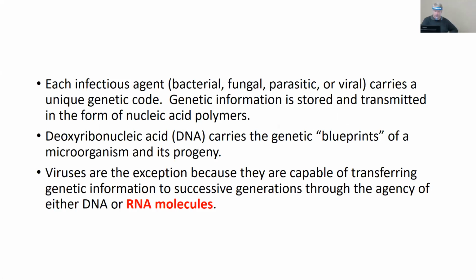So what is the technology? What are we doing with genetic testing? Each infectious agent carries a unique genetic code. So code breaking is very important. That's how we knew the COVID virus was a new virus, because we genetically mapped it to see what it was, and it didn't match anything that's been around before. So we have that. We can store it, transmit it, and then we have to develop a blueprint, right? We have to see what we need, and then we take those little bits and pieces, and we mix them in, and we get something to bind to it. So that's what we do with these film arrays that we're going to talk about here in a minute.